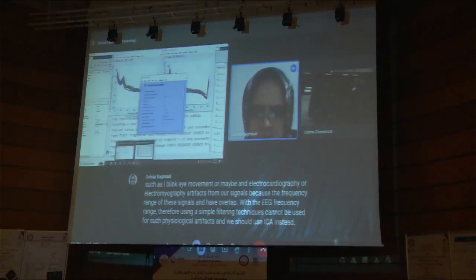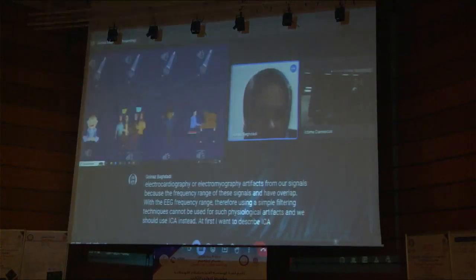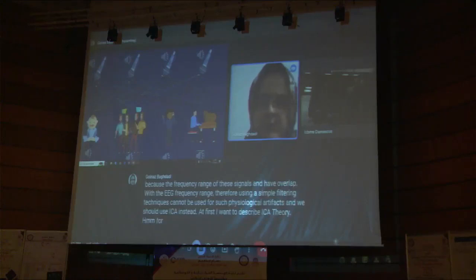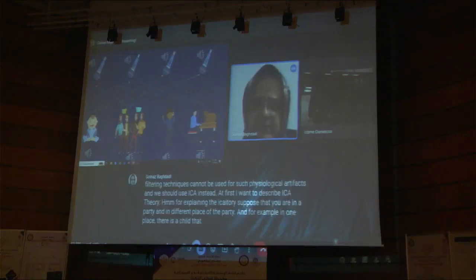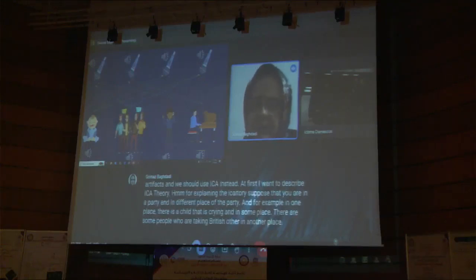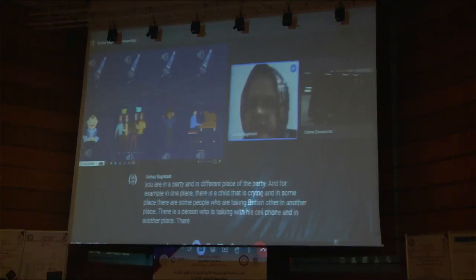At first, I want to describe ICA theory. For explaining the ICA theory, suppose that you are at a party, and in different places of the party, for example, in one place there is a child that is crying, and in some place there are some people who are talking with each other. In another place there is a person who is talking on his cell phone, and in another place there is a person who is playing a piano.